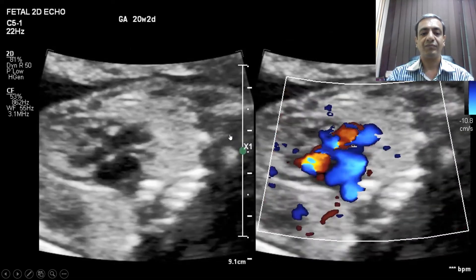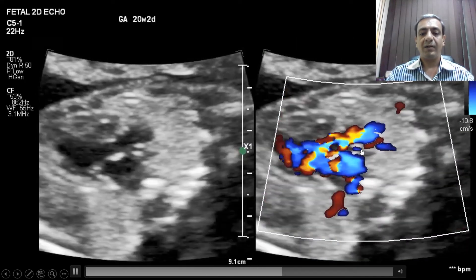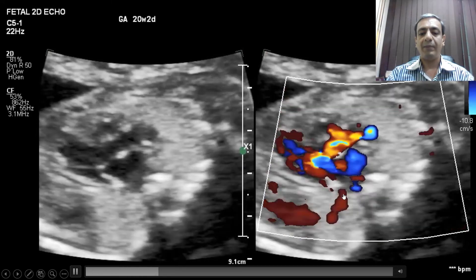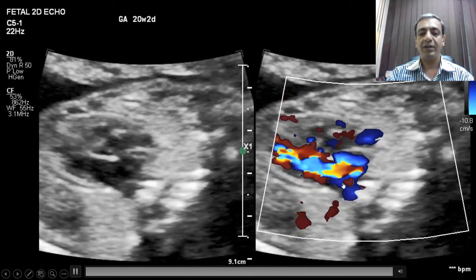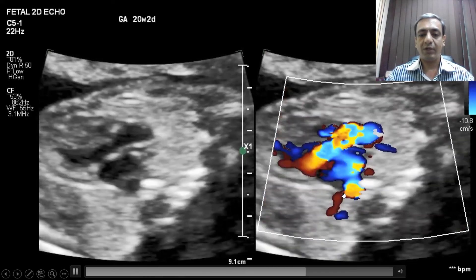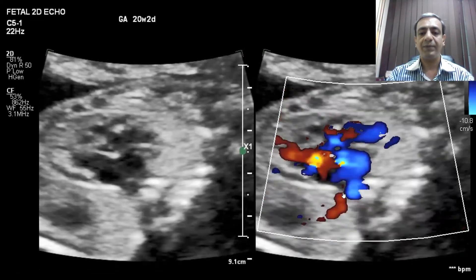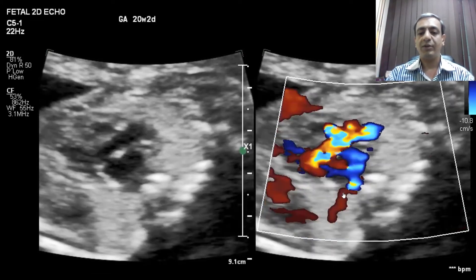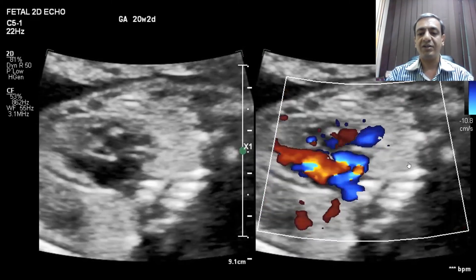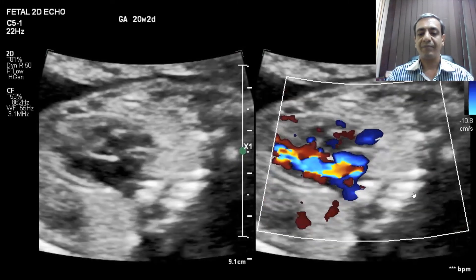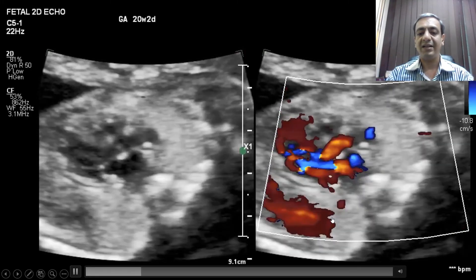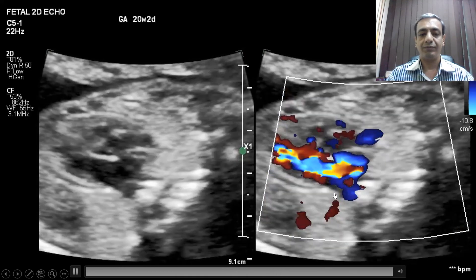I am trying to show pulmonary venous flow in this case. It is important to demonstrate pulmonary venous flow in every patient to rule out the possibility of anomalous pulmonary venous drainage. In this case, the left-sided pulmonary veins are seen clearly with red flow.